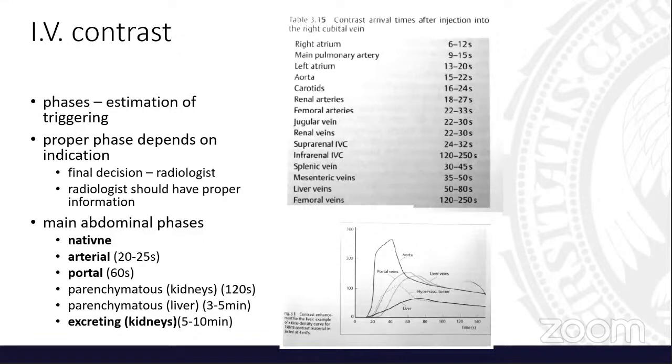So if you look, for example, at the dosages, the exposure that you get from a CT in the tables, it means the number that you get when you have, for example, four phases or something. So in general, when you do a CT, it's not as high a radiation as in the books, but it depends on the phases, because each phase means one dosage of radiation. So you need to think about that really, really well, if you're going to administer it or not. So that's this thing I wanted to talk about.